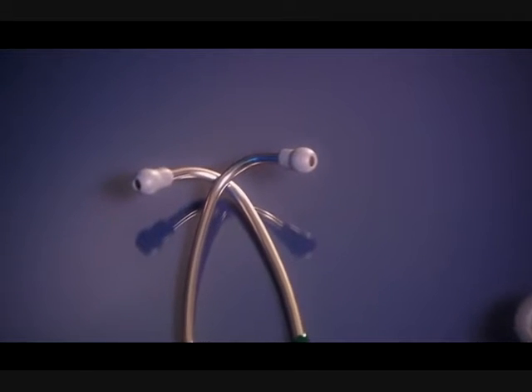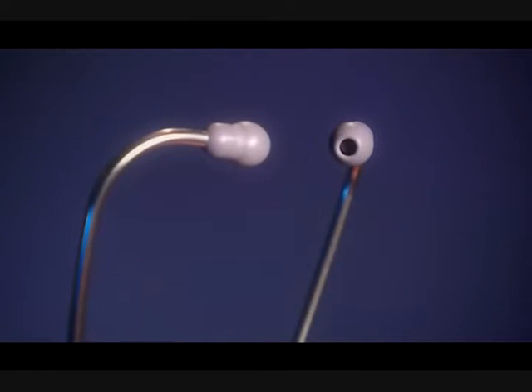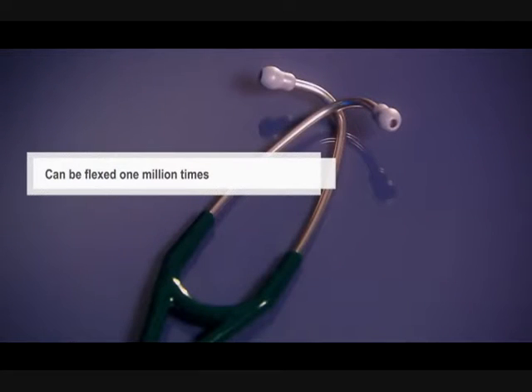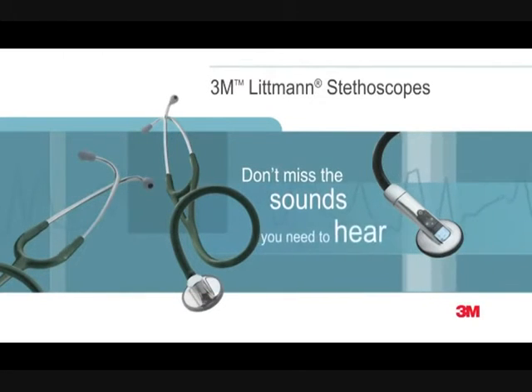Our soft seal ear tips with our patented snap-tight feature provide an excellent acoustic seal and comfortable fit. The anatomically designed headset, angled to fit the ear canal for maximum sound transmission, can be reliably flexed one million times. Littmann stethoscopes — don't miss the sounds you need to hear.